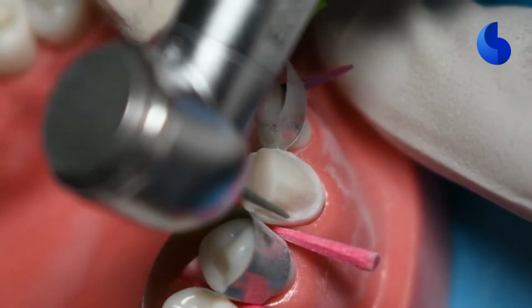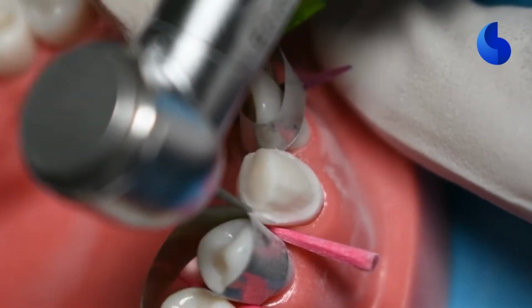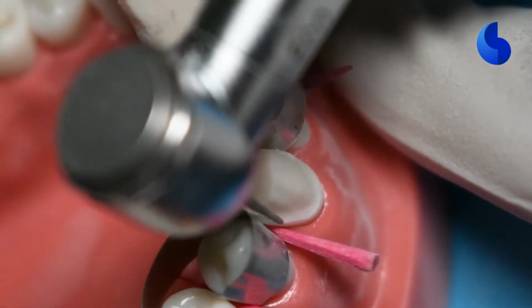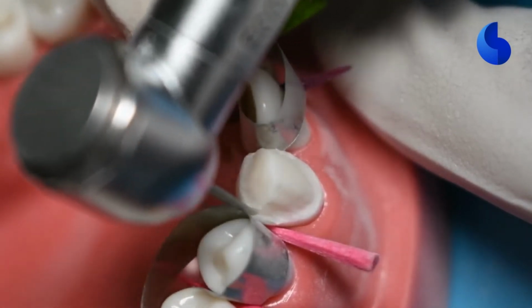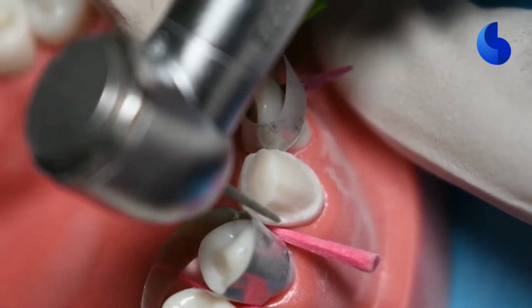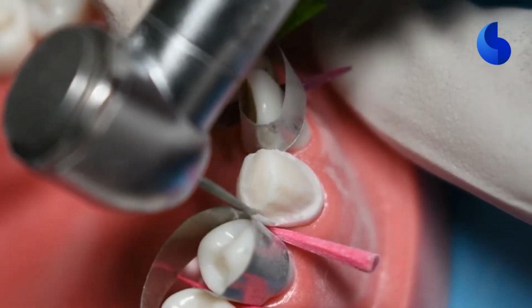You're using a very thin diamond burr over here, something like an 856-012 or a 169L carbide burr, which is really thin and helps you to navigate through this area and create enough space so that you can take a larger burr like an 856-016 through it to establish the margin you're looking for, that's 1 millimeter in width.